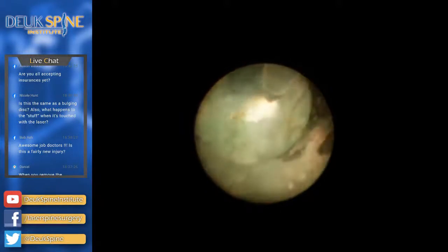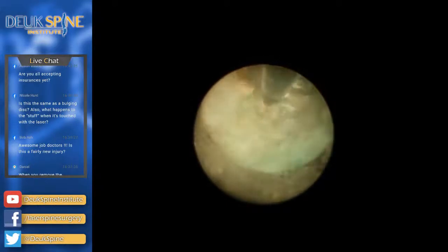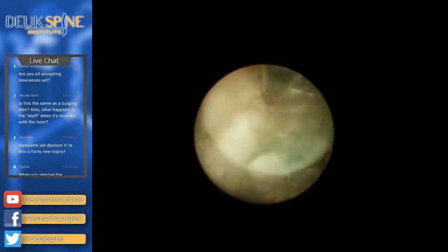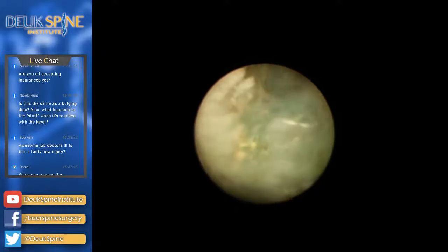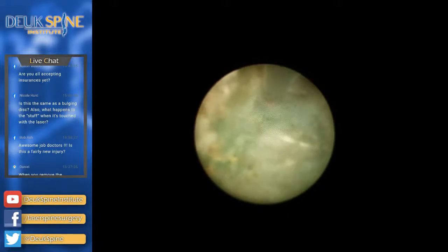Another question? Yes, we have another viewer on Facebook who's wondering, is what you're doing treating a bulging disc? And what happens to the material when it's touched with the laser fiber? So the laser is releasing energy onto this, and it's destroying the tissue. It's vaporizing it. Okay, it's annihilation, for lack of a better word. We call it vaporization. It basically injects the energy into the tissue, and it causes disruption of all the covalent bonds between the molecules. Basically, blowing it apart. Very powerful, very cool stuff.